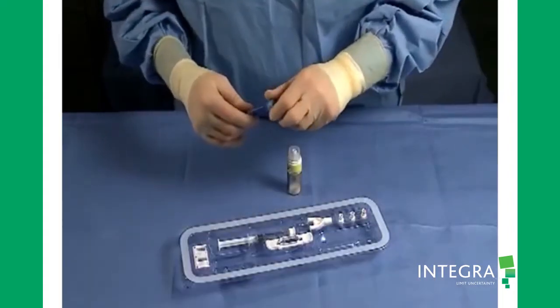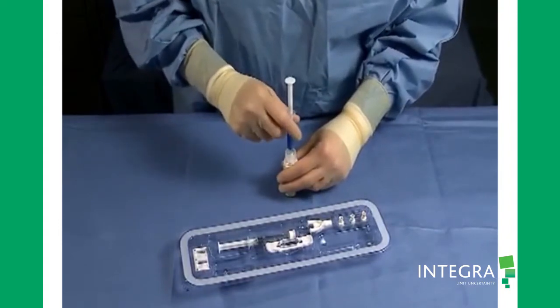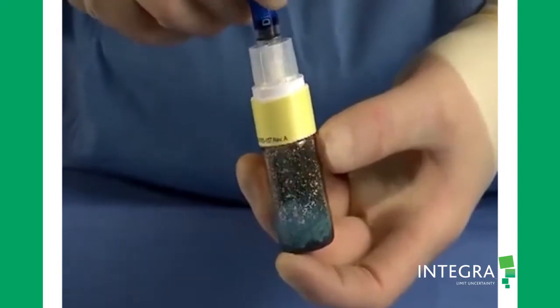Remove the blue cap from the blue syringe. Screw the blue syringe into the vial, depress the syringe, and empty the contents into the vial.